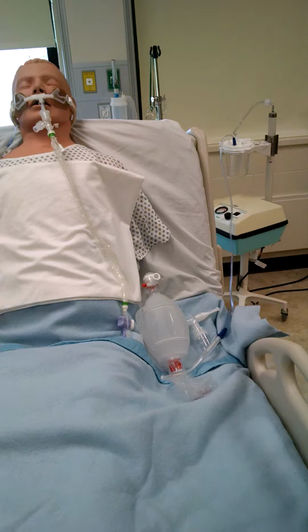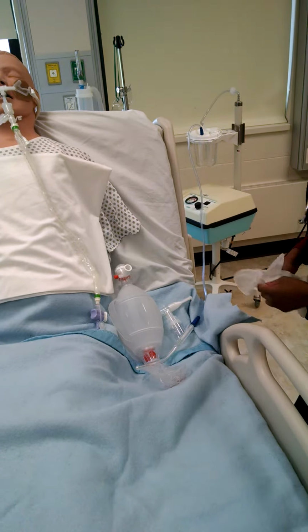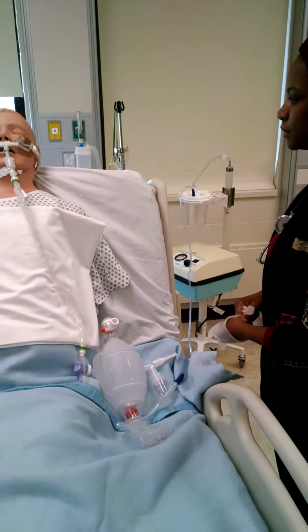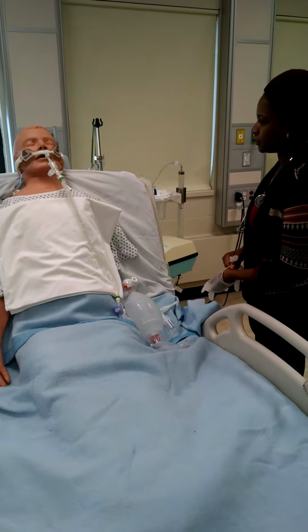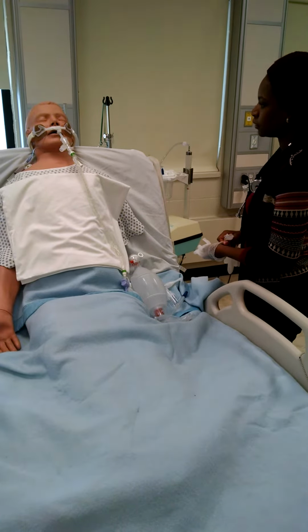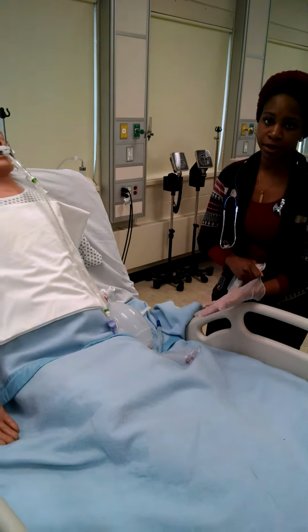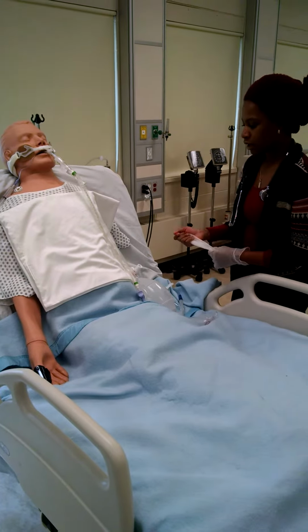So at this point, what I will go ahead and do is wash my hands and introduce myself to the patient. Hi, my name is Brittany. I'm a respiratory care student, and I'm here to extubate and remove your tube. Is that okay with you? Great. All right, so at this point I will go ahead and verify the patient's name and date of birth. Make sure that's the right person. I can look at his band also.